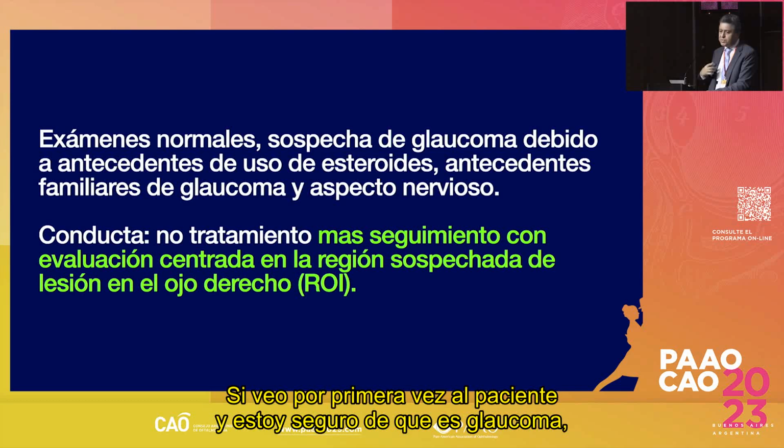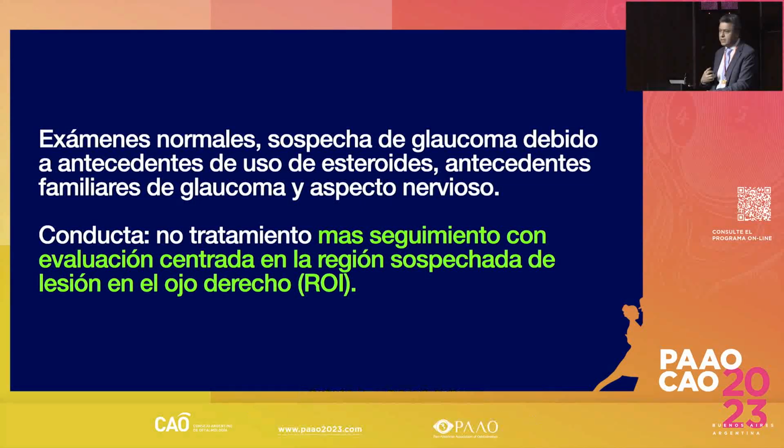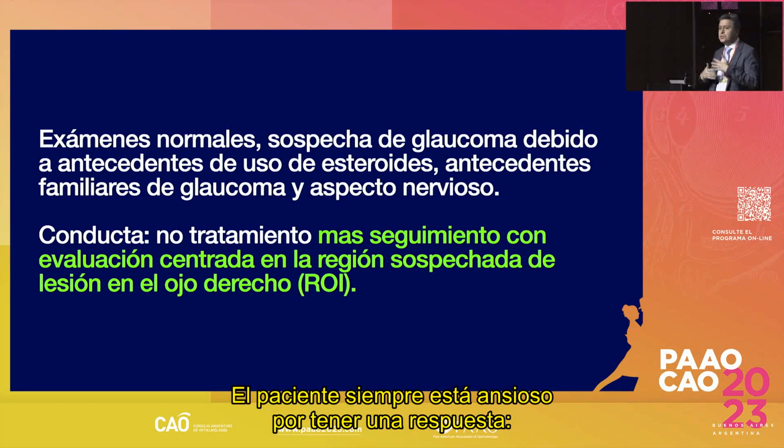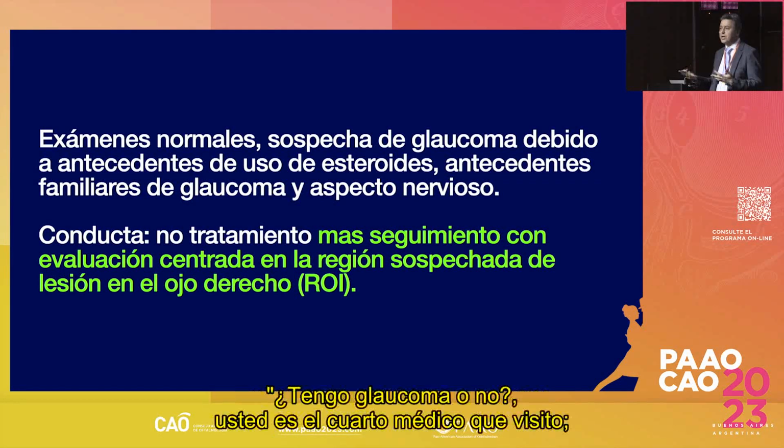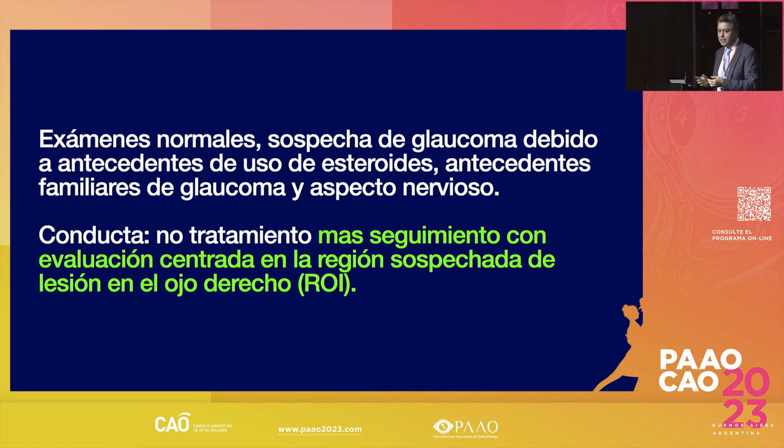Because when I look at a patient for the first time and I'm sure that it's glaucoma, I get the feeling that I'm arriving late on this case. So being suspicious is good, and the patient is very anxious to have an answer. Do I have glaucoma? Do I not have glaucoma? You're the fourth doctor that I'm seeing. The first one was saying bad things about the second one, and I just want to leave here knowing if it's glaucoma or not. So being suspicious is good.